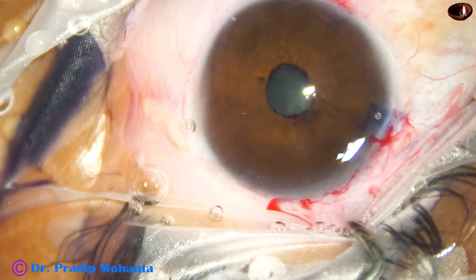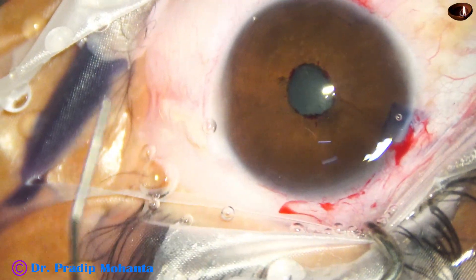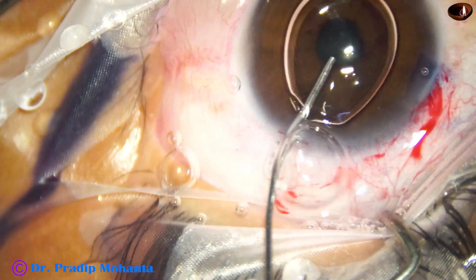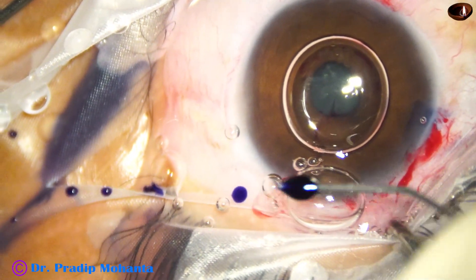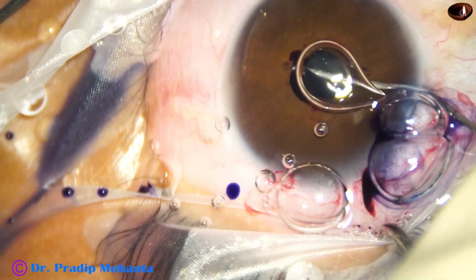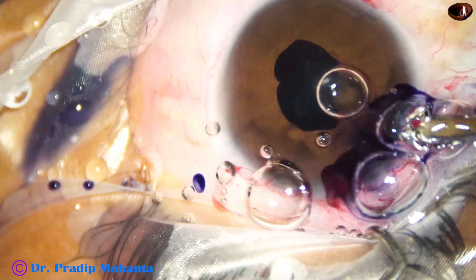And now the size of the pupil is about 2.5 millimeters. I inject an air bubble. My plan is now to go behind the iris with dye and inject some dye under the iris so that it helps during capsulorhexis. So I have injected a little bit of dye under the iris, and then I wash out this dye.